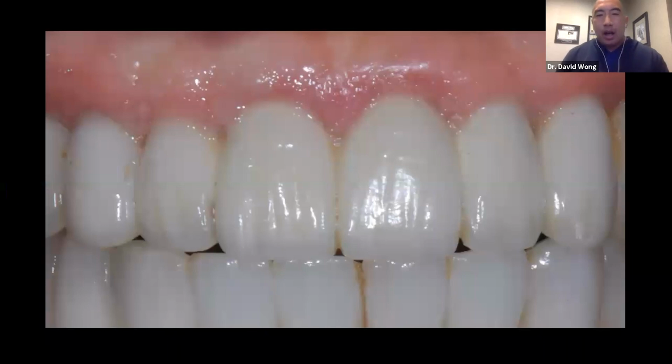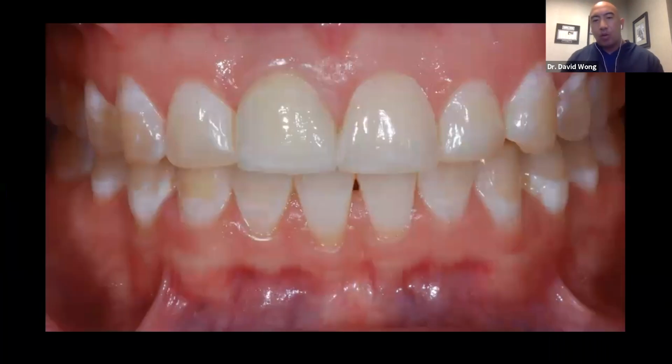So the purpose of dental implants is that we can't tell that they're dental implants, right? That's why patients come to us. They want teeth. They don't really come to us asking for implants. They come to us asking for teeth. So we want to get to a result where we can look at a photo like this and not be able to tell that the implants are number 6, 8, 9, and 11, right? We want to not be able to tell that the implant's tooth number 8.